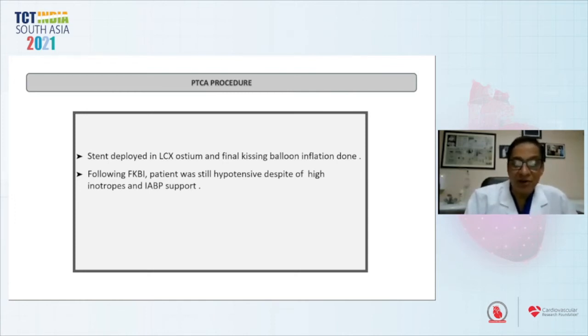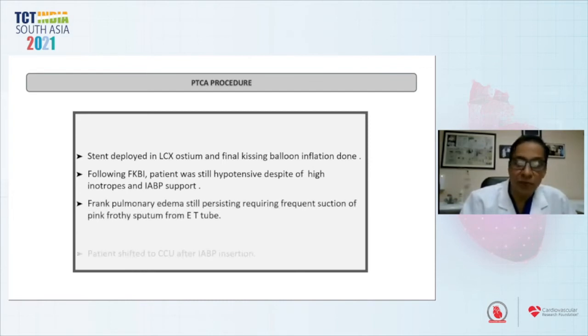you cannot allow the guiding catheter to deform that stent. So the best option is to place a guide extension inside the stent, and everything becomes very smooth. So I think we took hardly 6 to 7 minutes to fix up everything and do the bifurcation also.